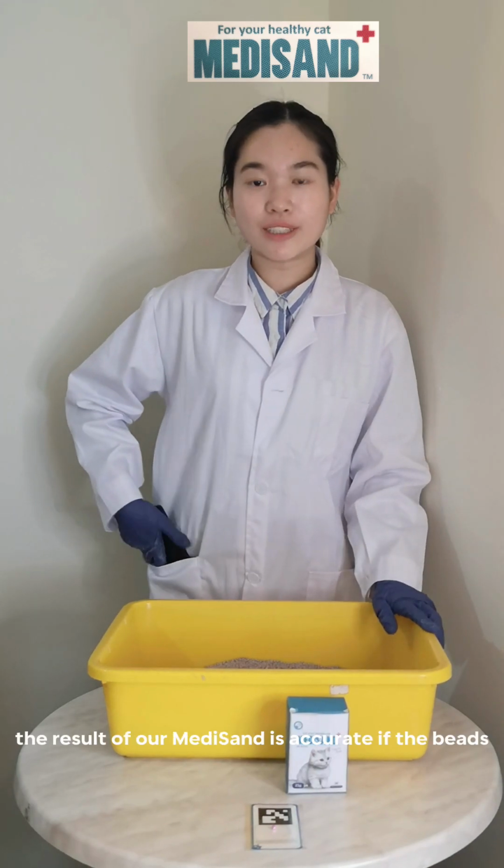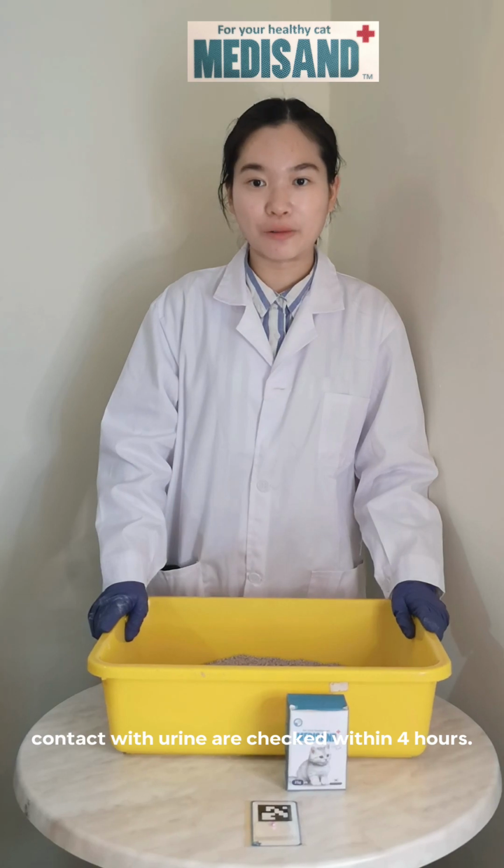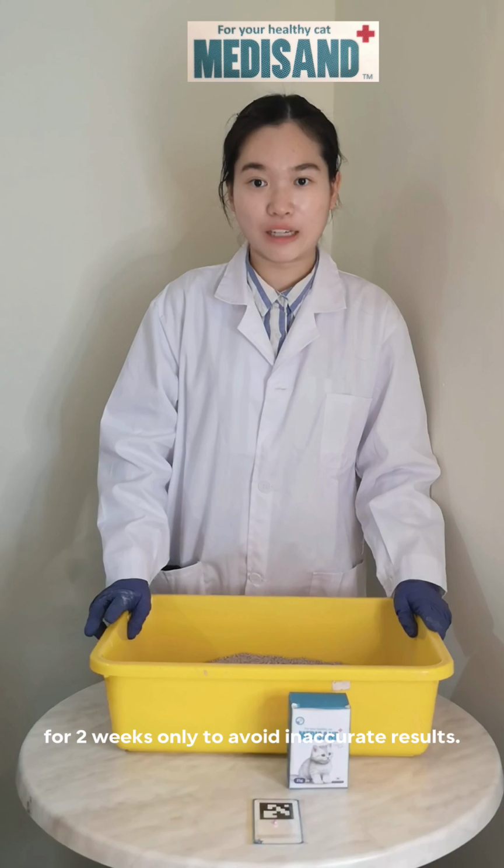For your information, the result of our Medisand is accurate if the beads that contacted urine are checked within 4 hours. 25 grams of beads can be used for up to 2 weeks only to avoid inaccurate results.